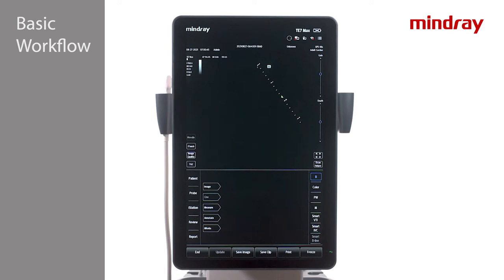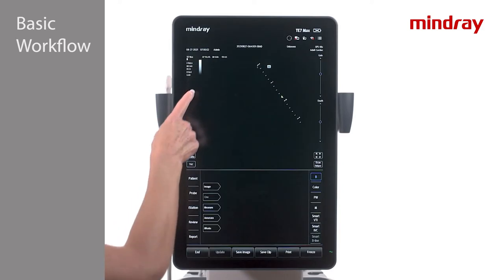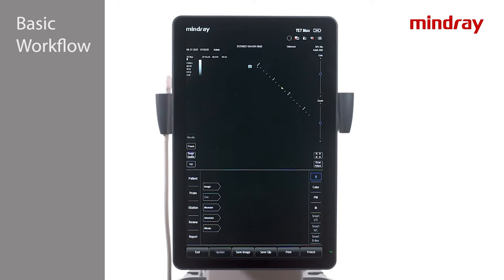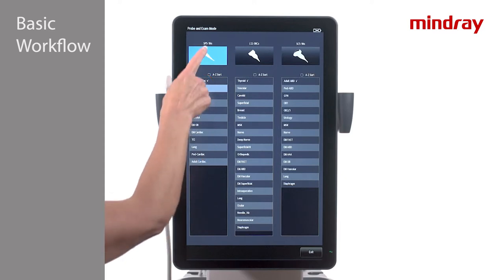Next, tap the Probe tab. This is where both transducer and exam mode are selected. Tap on the name of the desired exam mode to begin. Note: tapping on the picture of the transducer will bring up the default preset, which is demarcated by a check mark on the list.